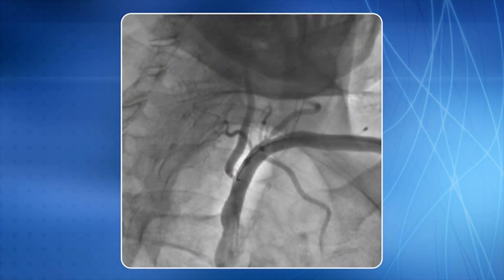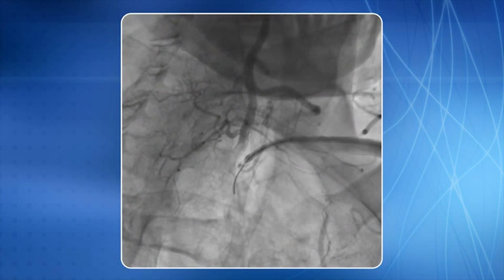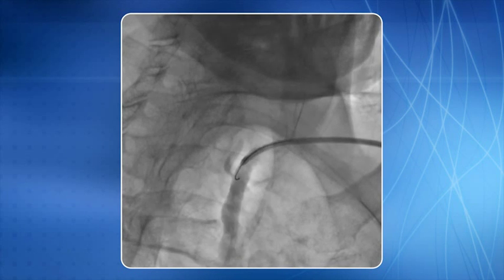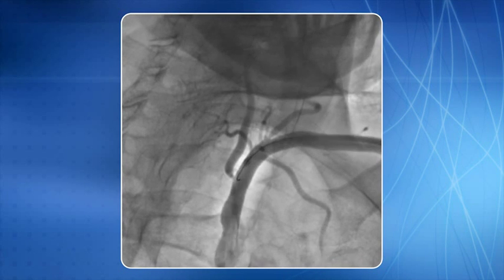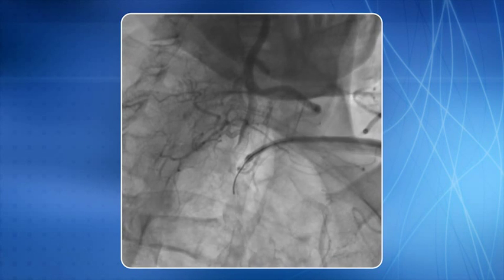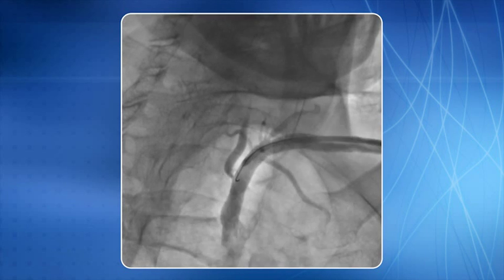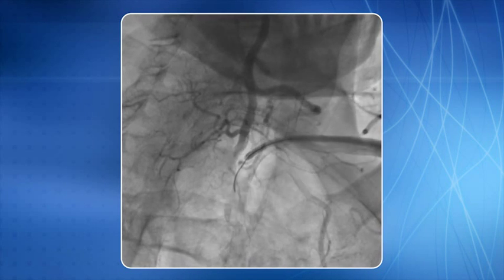Here we will show a few examples of ostial vertebral, intracranial vertebral, and basilar artery lesions and how we dealt with them using the transradial approach. This is an example of a tight left vertebral ostial stenosis addressed using the left transradial approach. You can see that the lesion is profiled.